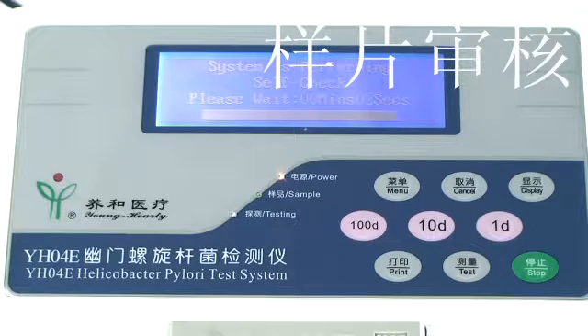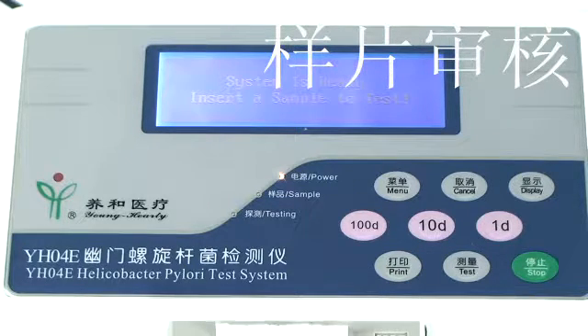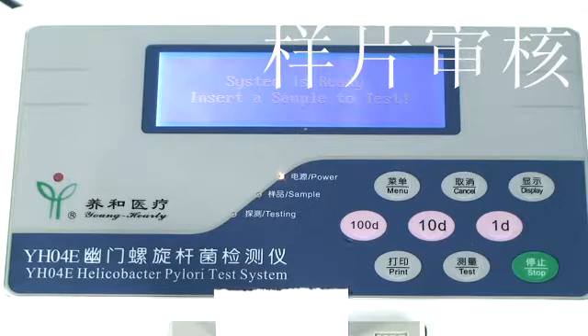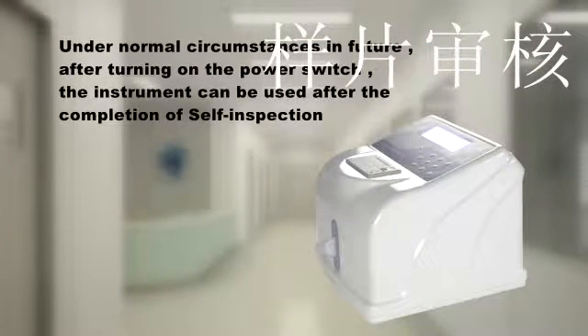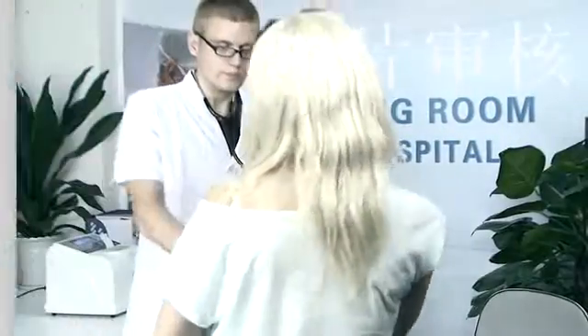Once the self-inspection and self-adaptive environment process is complete, the built-in mini printer will output the system self-test results and adaptive environmental results. Under normal circumstances in the future, after turning on the power switch, the instrument can be used after the completion of self-inspection.